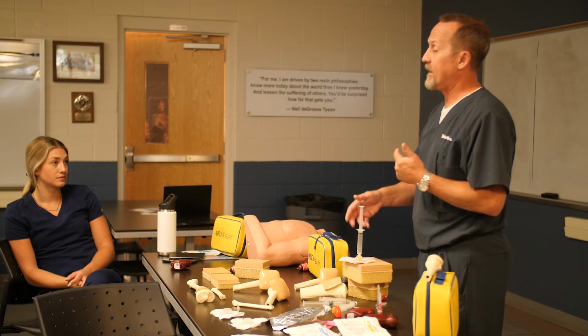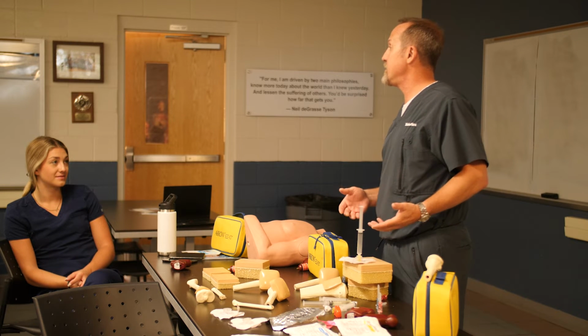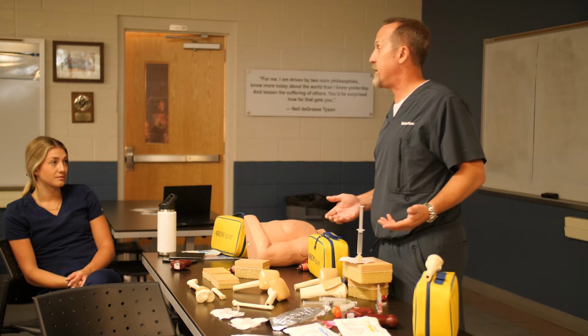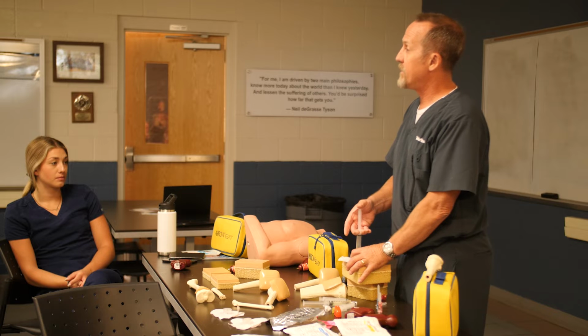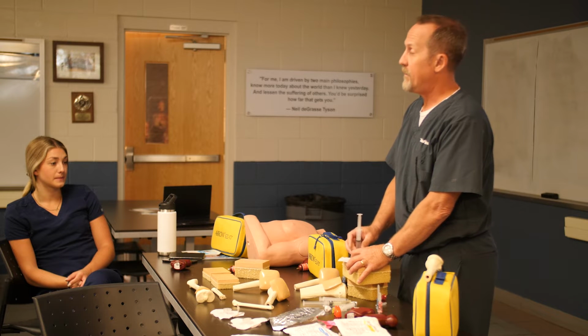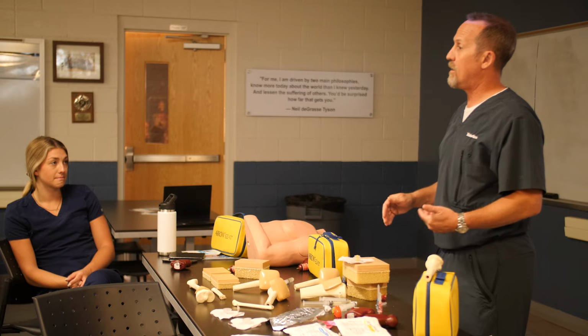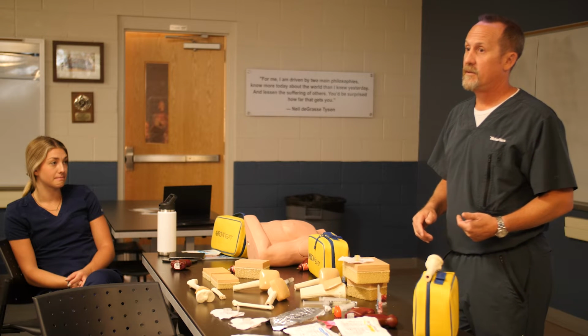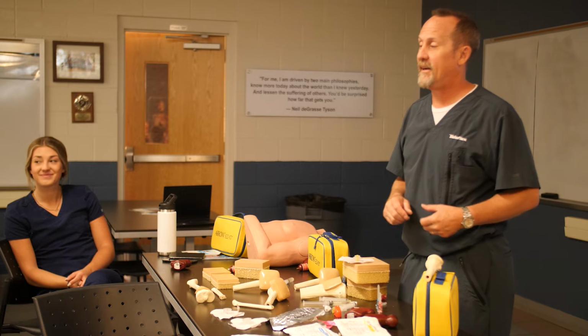And I'm talking like real 2 minutes, not emergency minutes, okay? Because if we put it in too rapidly, it's gonna hurt. There's no point in using lidocaine, okay? So we're gonna let it trickle in over a 2 minute period, trickle. Once we've achieved putting that entire dosage in, we can actually remove the syringe, and now we're gonna let it dwell for 60 seconds. And my other joke of the day, we're gonna let it marinate in the bone, okay?